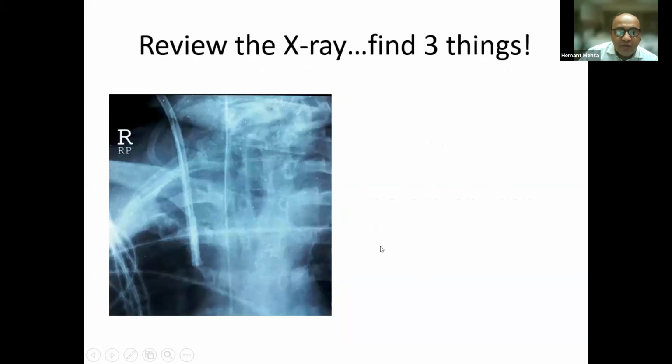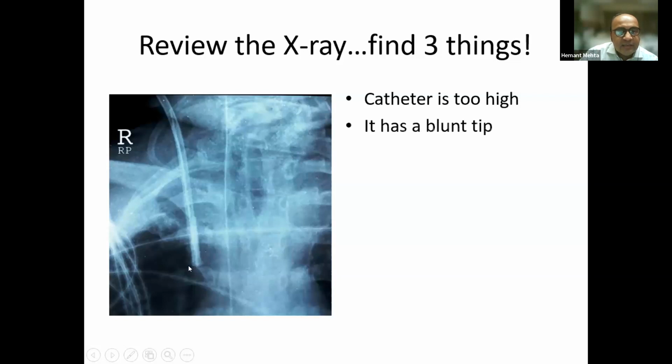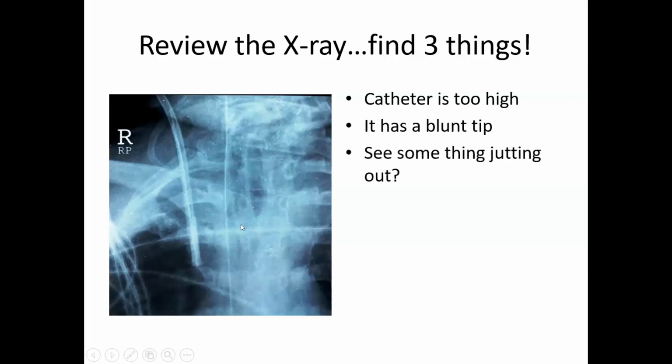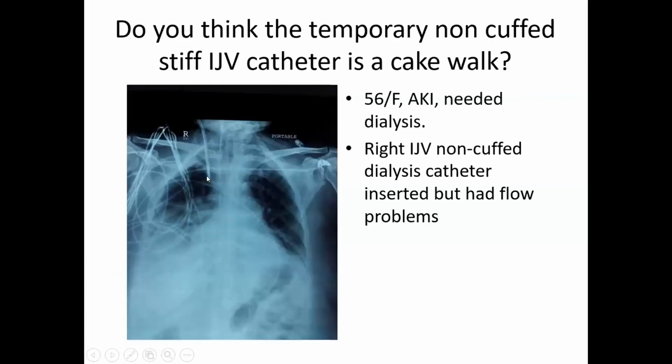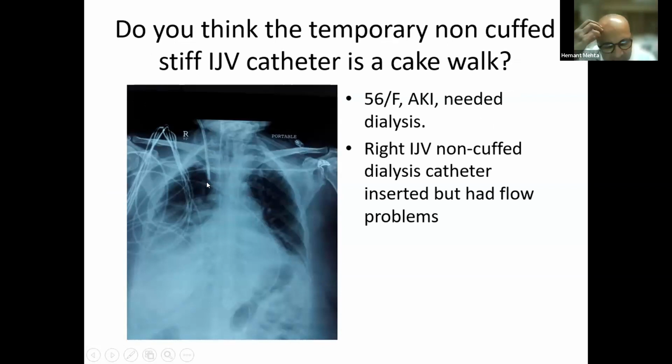If you look here, I'll show you a close-up view. The first thing you realize is that this is blunt here. The second thing you would have realized is it's quite high, just below the clavicle. Even if you put a 13.5 centimeter Mahurkar WMN or Aero WMN catheter, it would at least be somewhere at the SVC-RA junction, the cavoatrial junction. So this is way above that.